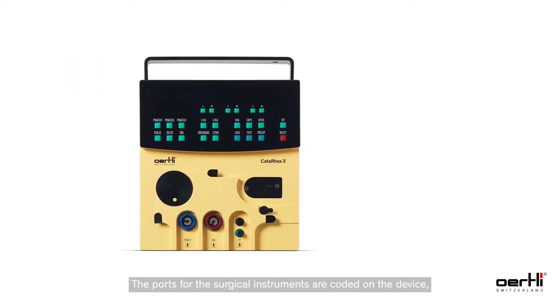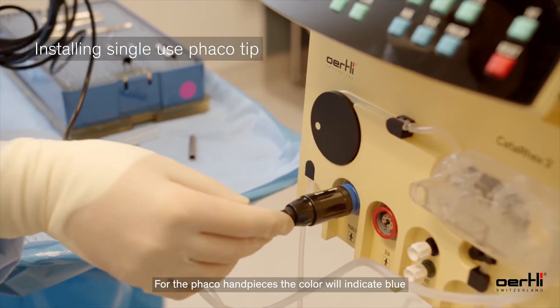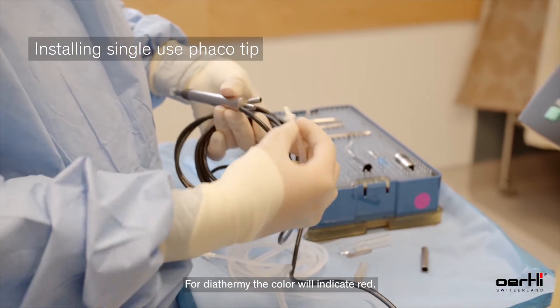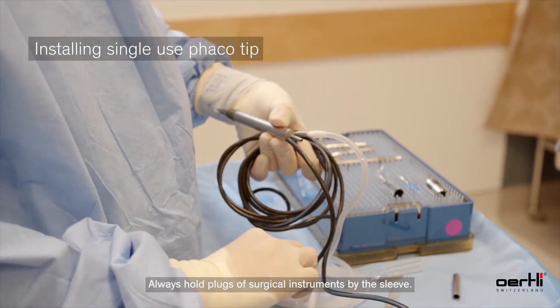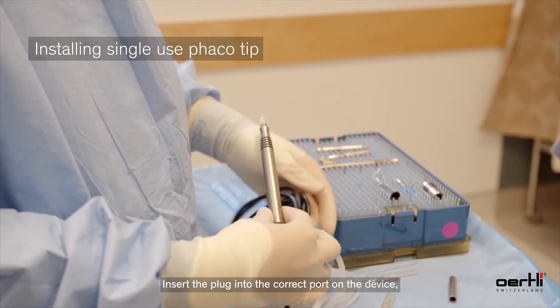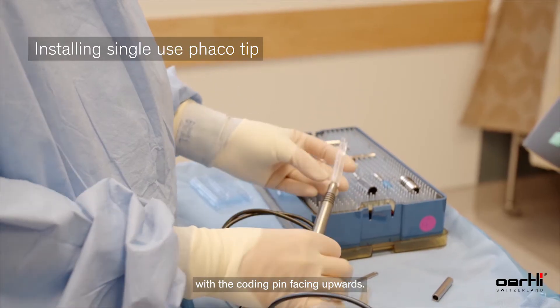The ports for the surgical instruments are coded on the device both by color and by mechanical means, making it impossible to connect the instruments incorrectly. For the FACO handpiece, the color will indicate blue; for diathermy, the color will indicate red. Always hold plugs of surgical instruments by the sleeve and insert the plug into the correct port on the device with the coding pin facing upwards.